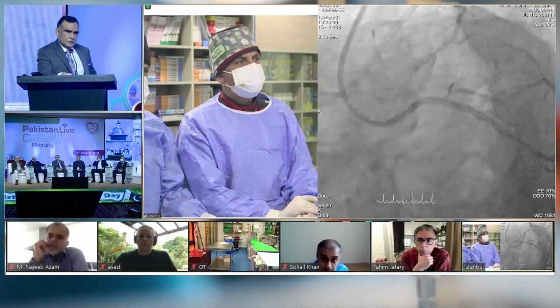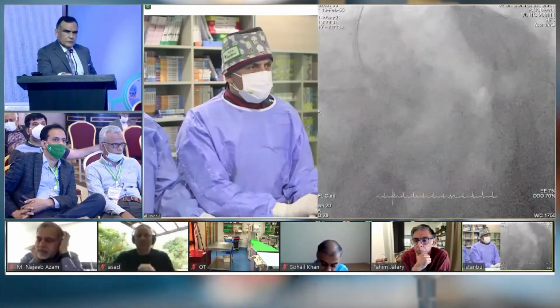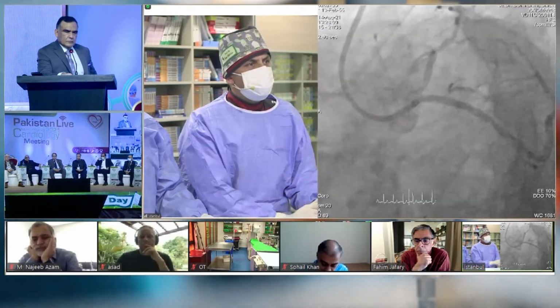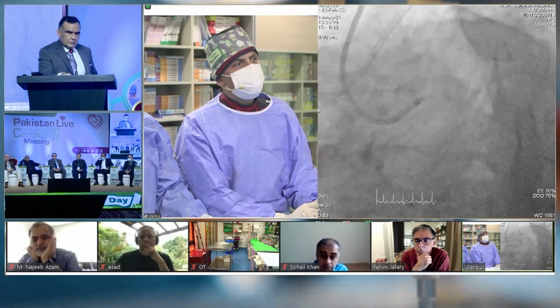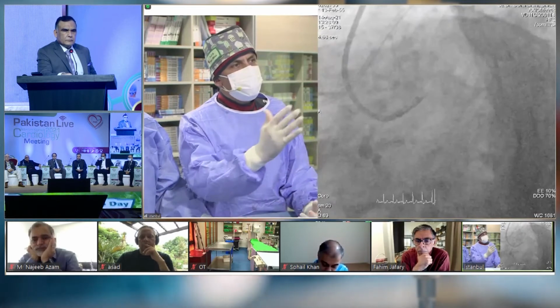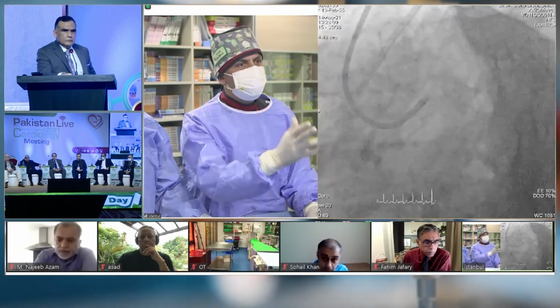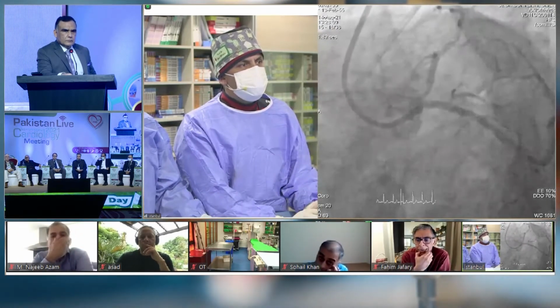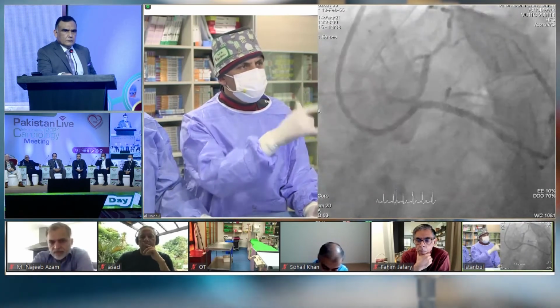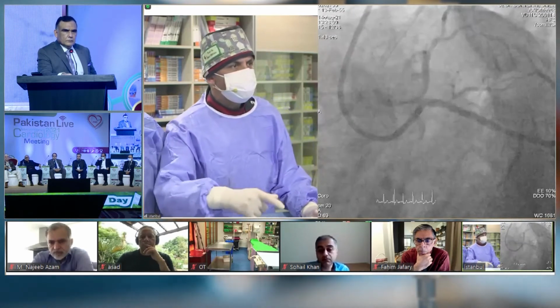Yes. Next, please. If you come back, the guiding catheter was in the circumflex. When we tried to go to the LAD, we pulled our guiding. The circumflex hung our catheter, but we failed to reach the LAD with that maneuver.